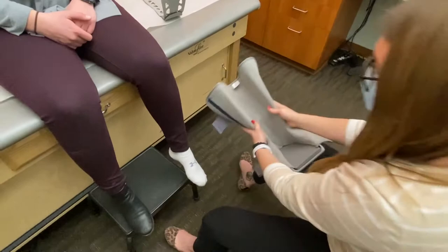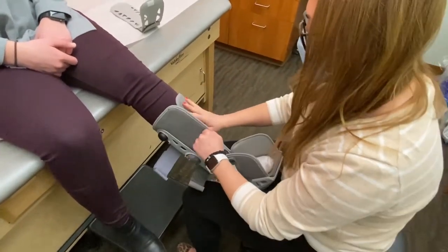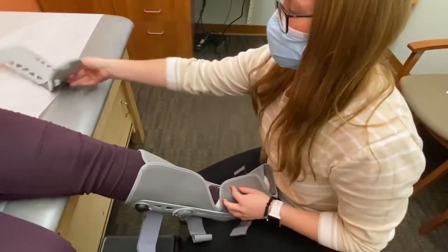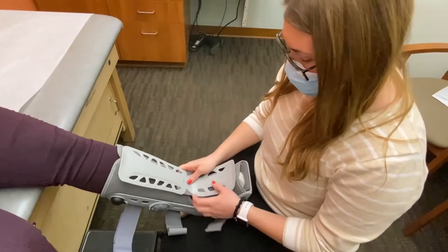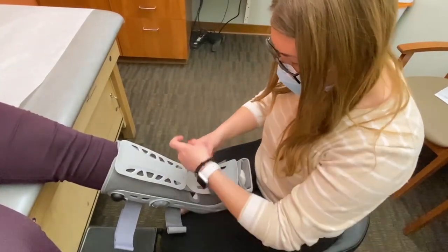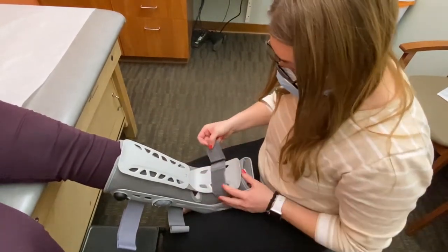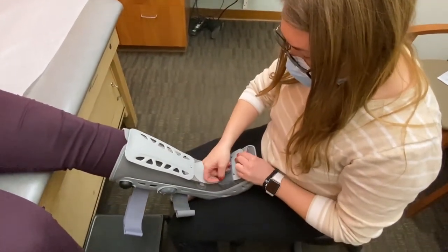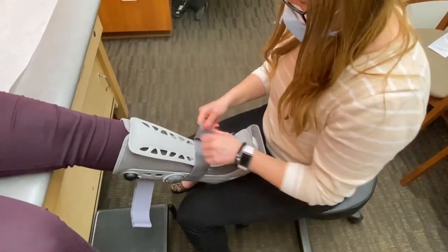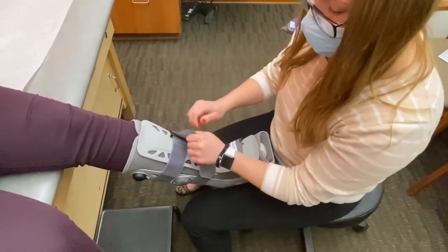You'll slide your heel into the back with your foot nice and flat on the bottom of the boot. Secure over the top with your foam and then replace your cage. Remember to go nice and light over the toes — you don't want to cut off circulation. It should just be snug enough so you don't feel like your foot's going to fly out of the boot. Then you'll secure across the shin.